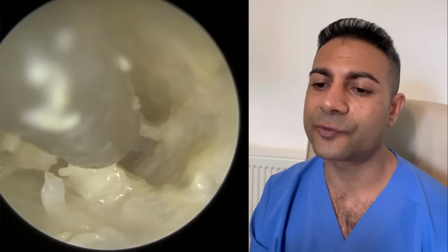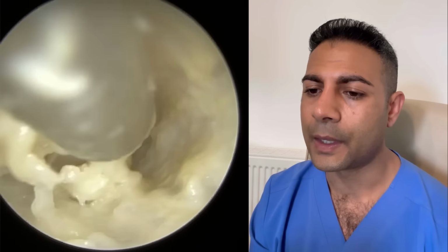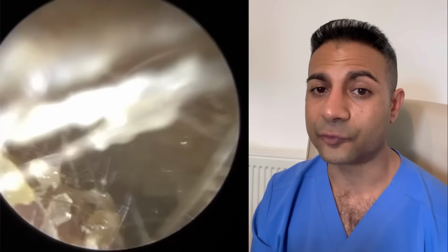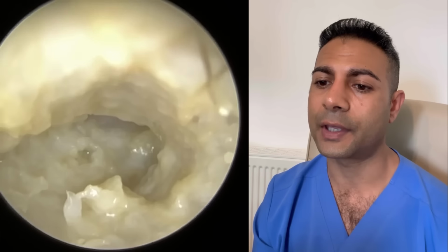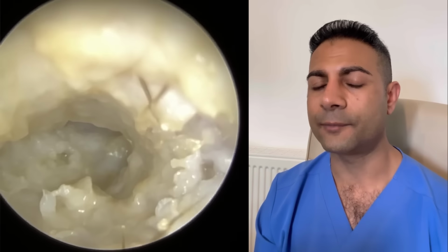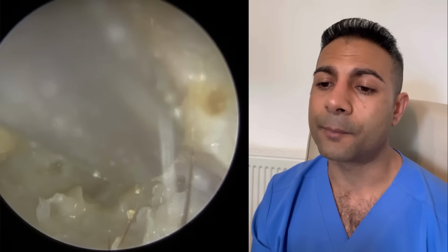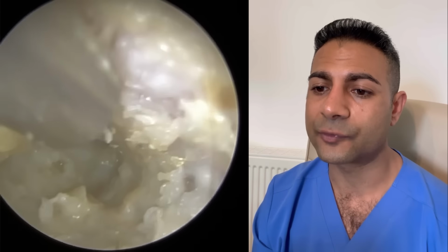Now, I'm not 100% sure if this is bacterial or fungal. So I have written to the patient's GP post-procedure, and I've requested that they have an ear swab taken to confirm the presence of either a bacterial or fungal infection, or indeed both, prior to them being prescribed medication.